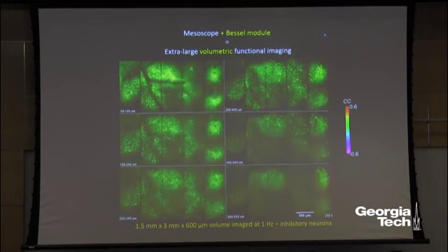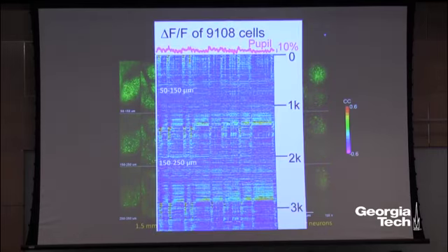Again, this mouse is not actively engaged in anything, it's just sitting in the dark, but by no means is its brain silent. You see all this spontaneous activity of those inhibitory neurons. And if you stare at them carefully for long enough, you also get almost an illusion of waves going from different regions. But then, of course, we have very high lateral resolution.